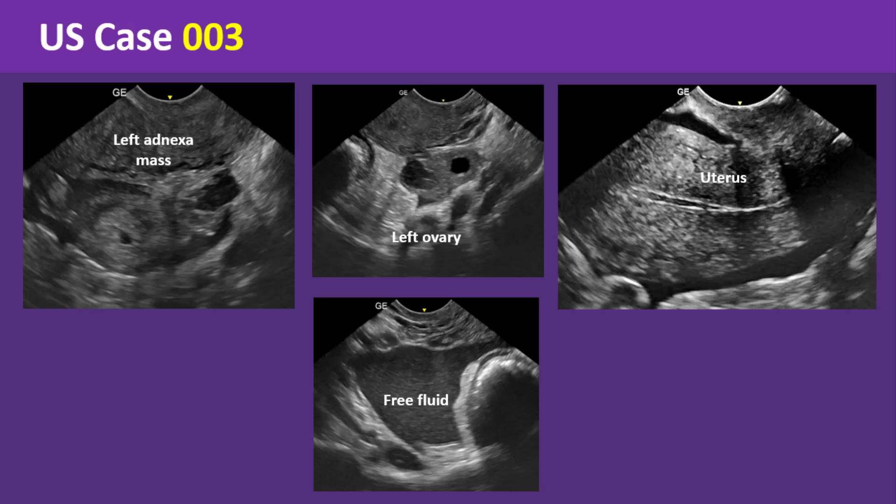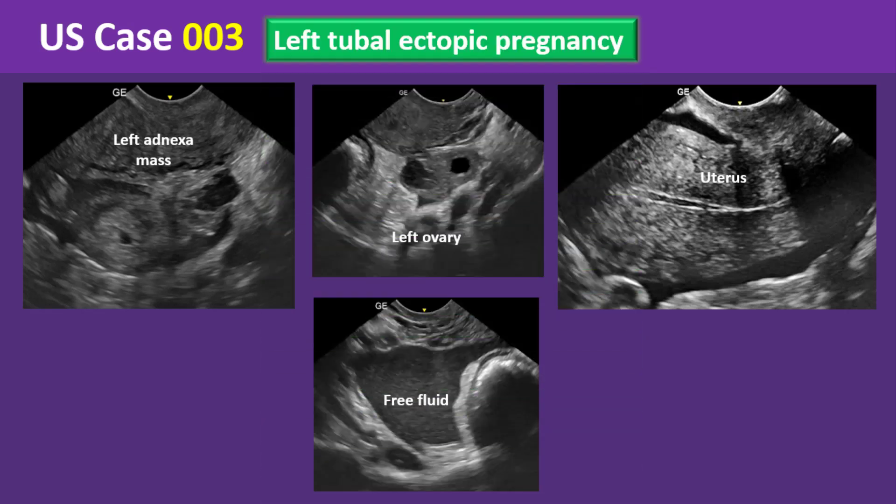There is a considerable amount of free fluid seen in the pelvis that shows homogeneous low-level echoes, highly suggestive of hemoperitoneum. These findings are suggestive of left tubal ectopic pregnancy.